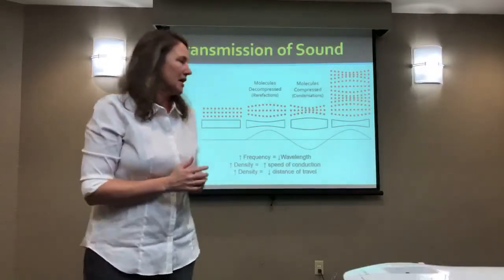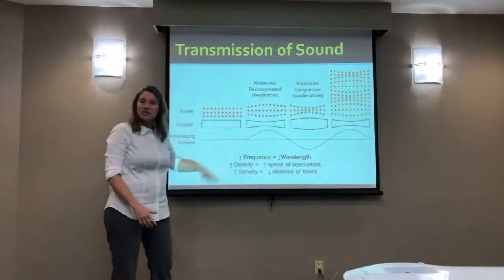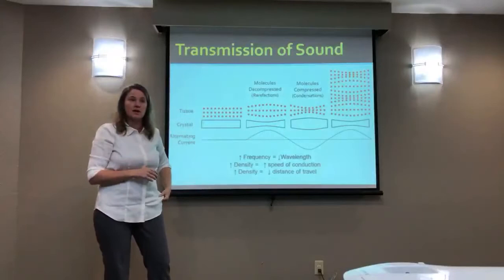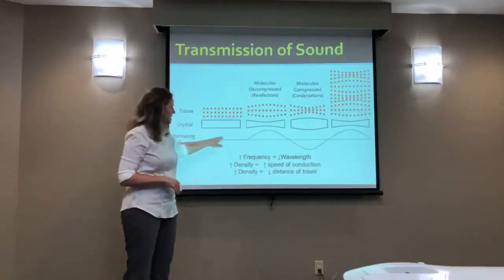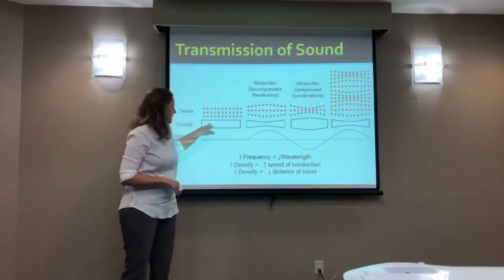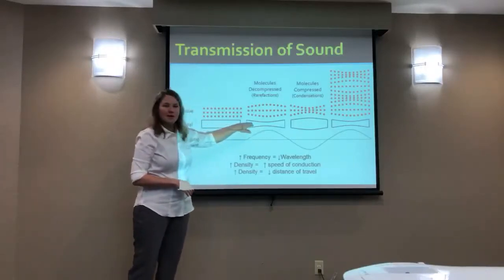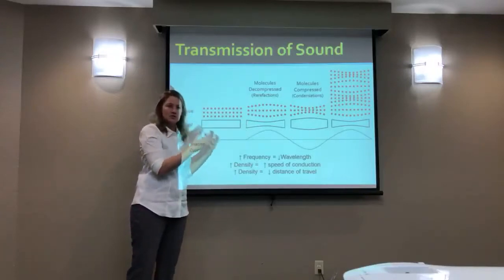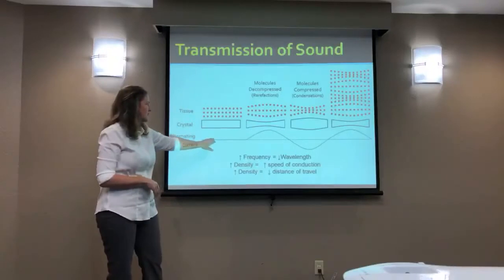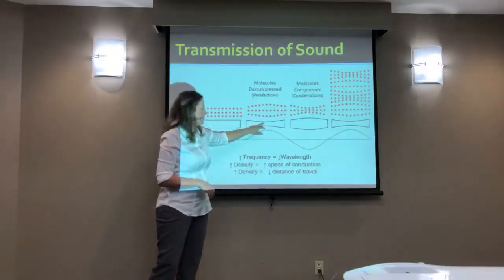So what's happening is, as in this picture, you have an alternating current. Your machine is creating it. The machine is calibrated in a way that it will cause an alternating current to vibrate at the rate you're looking for. So your crystal is going to expand and contract in relation to the vibration, the frequency that it's receiving. And what's going to happen is it's going to create a pushing and pulling force.